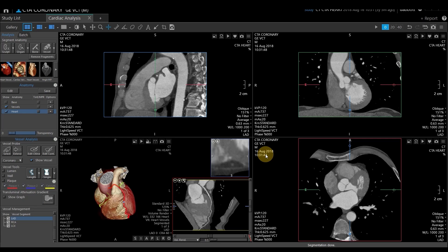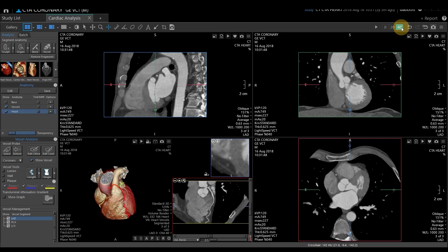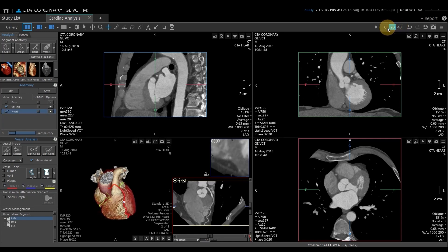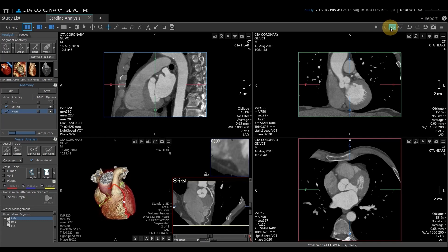We loaded in three phases. The three different phases are going to be located in the upper right-hand corner. You can toggle through the different phases to see which one might have the better image — least amount of motion — the one you want to look at. You can look at different vessels in different phases for better evaluation.